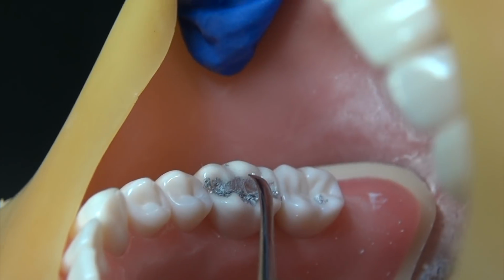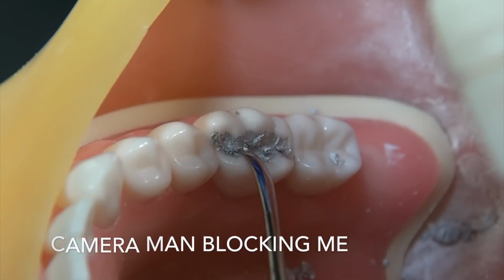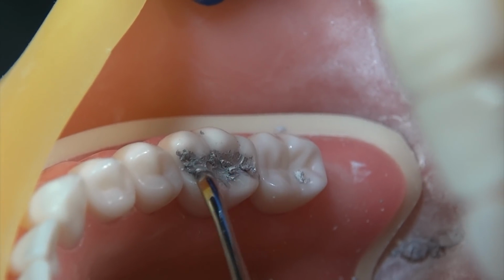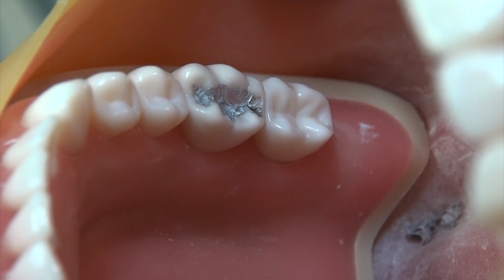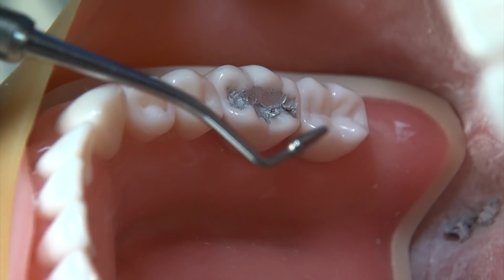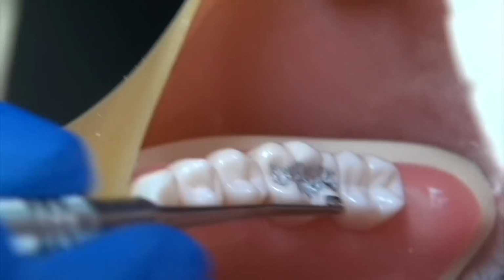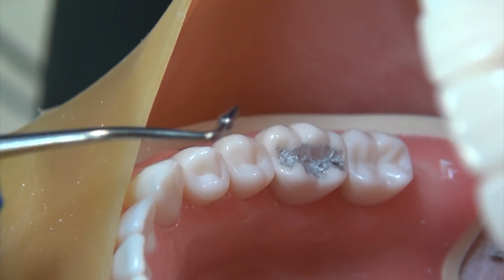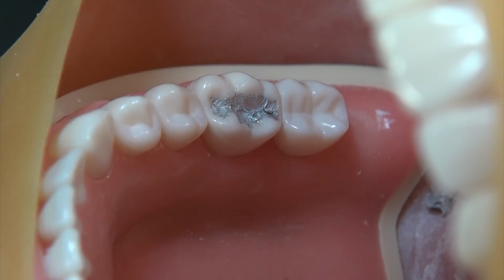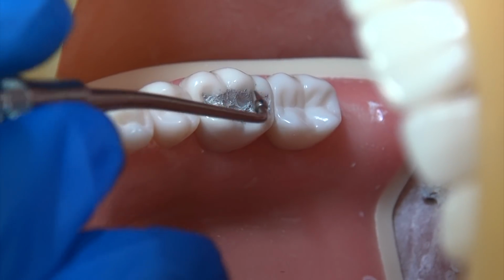Can't get into that angle. Okay, another great instrument to use is going to be your PKT, and I like to utilize the longer, skinnier end of the two. So one's longer, one's shorter and fatter. Comes down to preference.